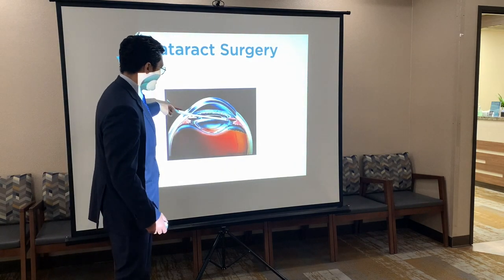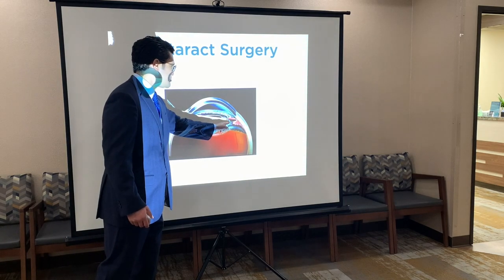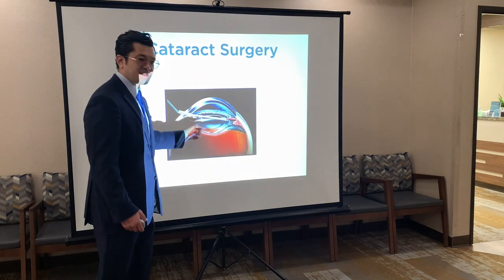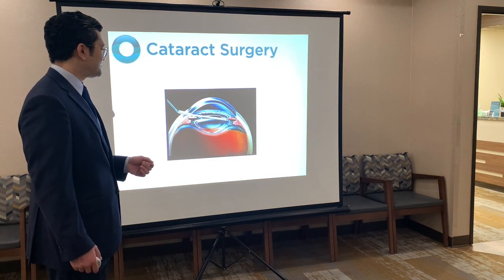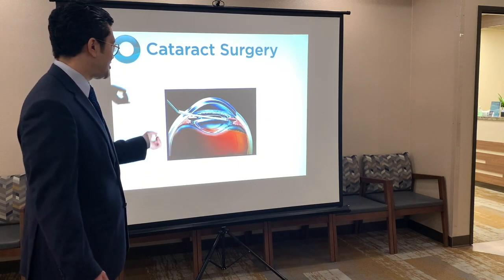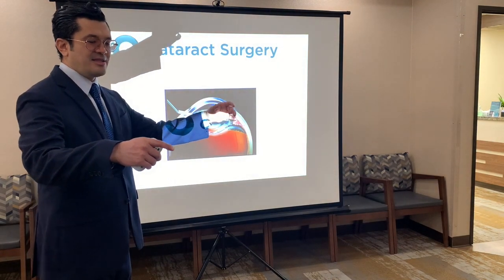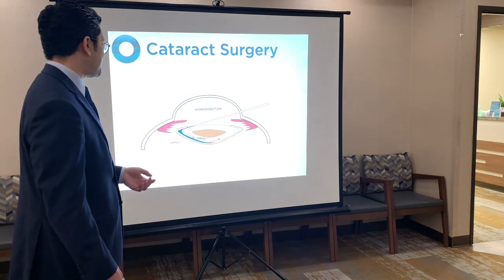So you can see that cannula goes here, it tips right underneath the capsule, and then we infuse it with the saline, which will wrap all around the back side. And we'll open up the bag, creating a separation between your cataract and the capsule. So I love that step. After we do that, a lot of surgeons, myself included, will then grab that lens and make sure it's free. We're going to spin it around inside the bag. So you can see the bag, and then your cataract, we're going to spin, maybe 180 or 360 degrees.